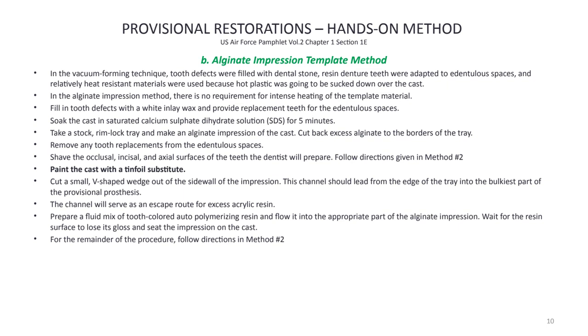And for the patients to be able to heal, it's sometimes indicated to use those vacuum clear aligners because they can be set up to cover the palate, so it protects the area where the doctor took that tissue.